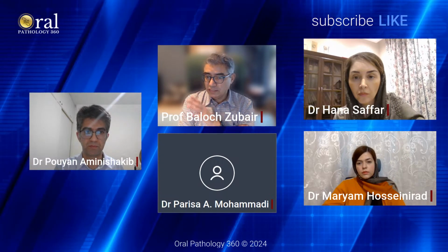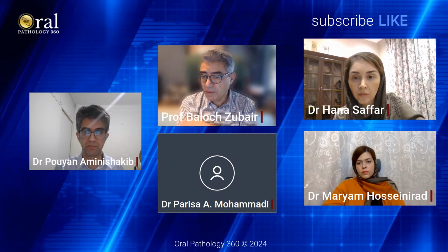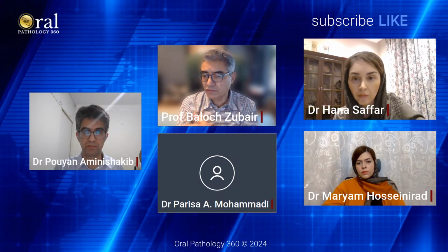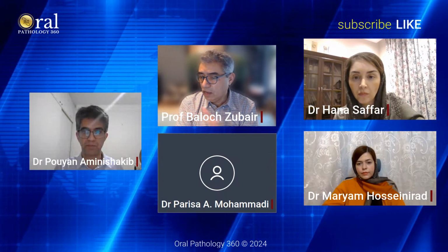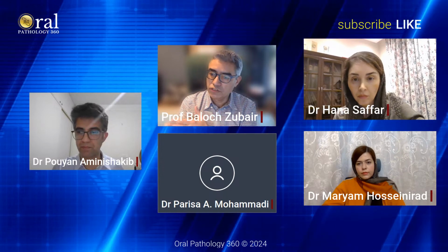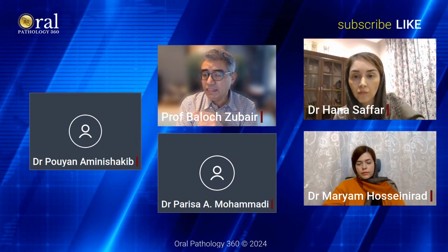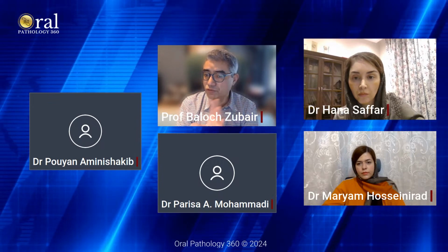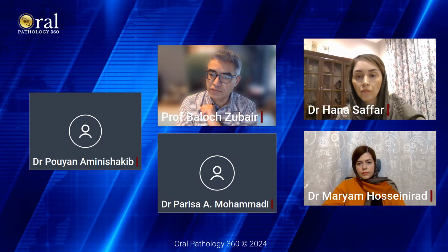If it is NR4A3 negative, S100 and mammaglobin positive, and GATA3 positive, I'm pretty much sure I'm in the secretory carcinoma category. I always sign the report out, and if I have a specimen, I'll do FISH, just to tell them that I'm doing a FISH, which I find really helpful. If I'm in that category, I try my best to do immunos and special stains to give them as specific a diagnosis as possible. I will share the question from Dr. Asma.